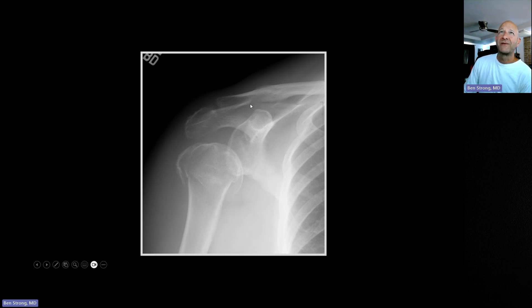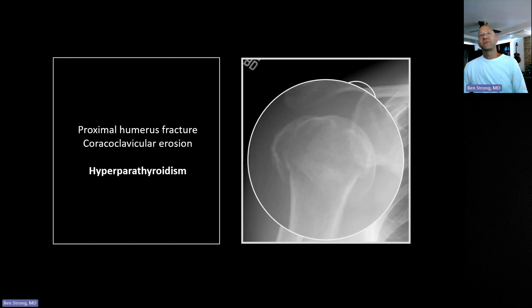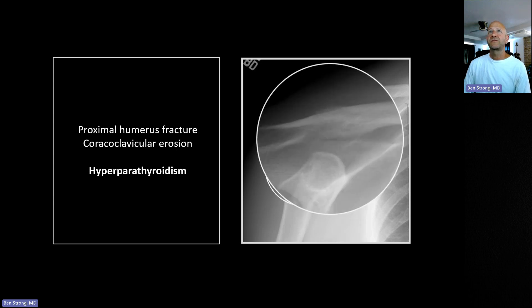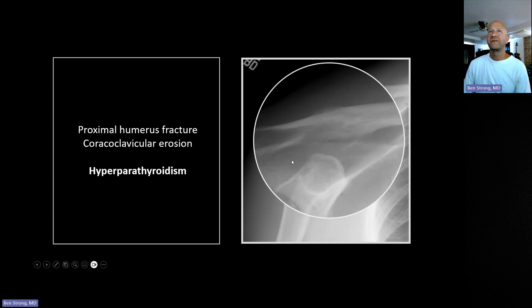From my private practice days, I spotted this and said this is a renal failure patient. They said no, she's not. I convinced them to get a parathyroid level and it was 450 when the normals were in the 40-60 range. They ultimately found a hyperfunctioning parathyroid adenoma. So: three-part humeral head fracture, inferior displacement of the humeral head denoting a hemarthrosis, and that coracoclavicular resorption suggesting a parathyroid abnormality — you can see how the cortex ends here, with that divot right there.